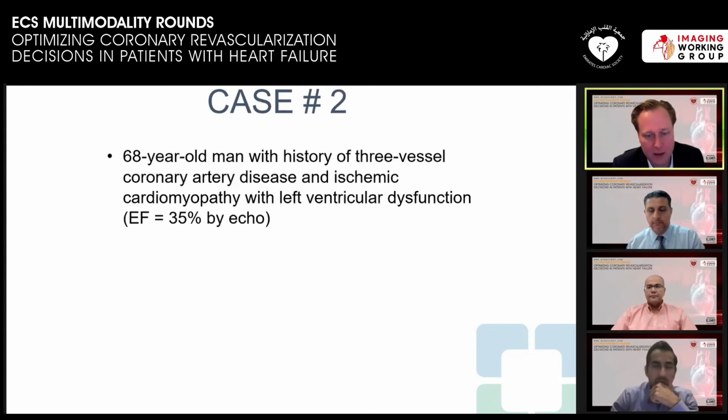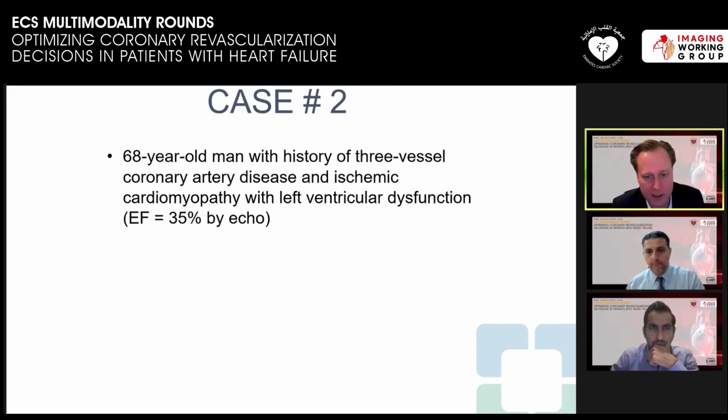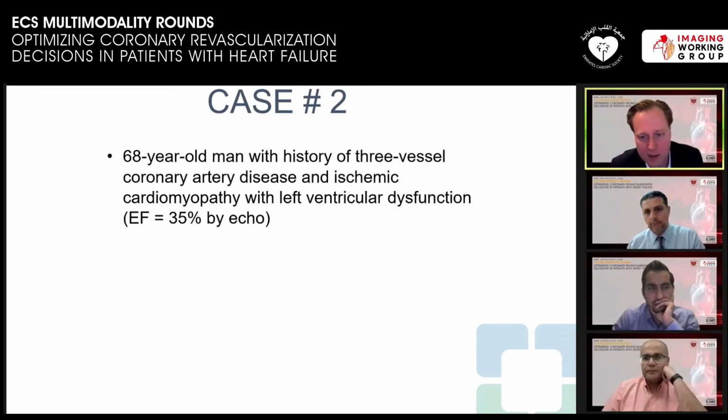From the technical side, there can be heterogeneity in terms of the myocytes utilizing free fatty acids versus glucose. So you can have normal myocardium that has normal perfusion, and even though you've prepped the patient with fasting and then glucose and insulin to try and shift the cells to using glucose as a substrate as much as possible, some of that normal myocardium may still be using free fatty acids and not light up. The other technical point is that this is all relative perfusion, so everything gets scaled down from where the counts are the highest. And it's going to be that ischemic or hibernating myocardium that is most intense with FDG uptake. So even if some of the other normal myocardium is using glucose, it may just be using much less, and so you don't really pick up that signal because it's been scaled down.